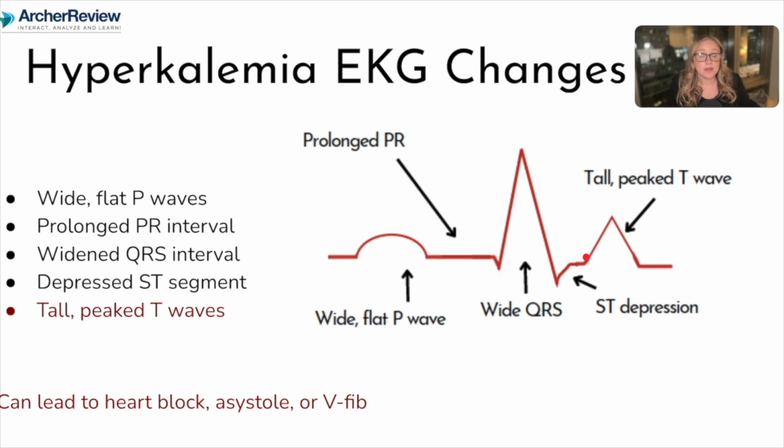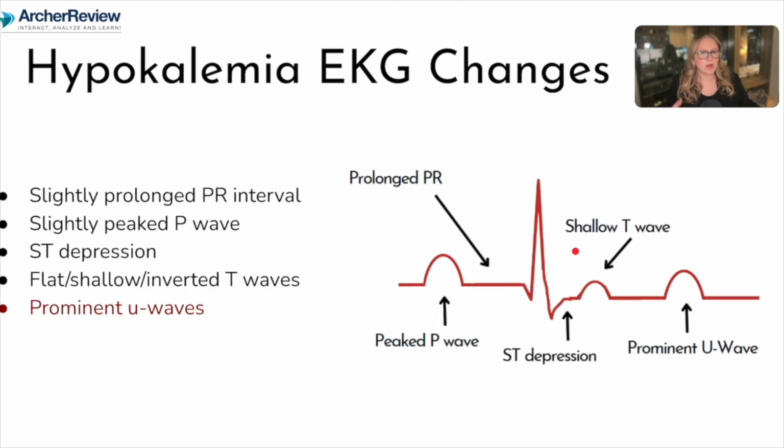Really important to notice if any of these EKG changes occur because they are kind of like a warning sign. They by themselves might not really harm your client. They're probably still going to have a pulse and be perfusing okay. But it can lead into heart block, ventricular fibrillation, and eventually cause cardiac arrest leading to asystole. So if I notice any of these EKG changes, I want to check my client's potassium level and address any hyperkalemia very quickly.